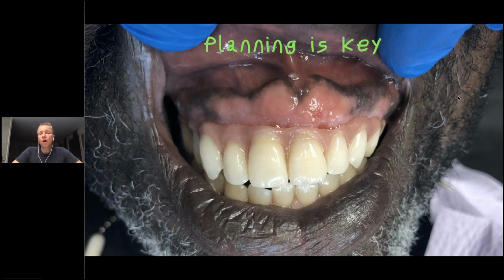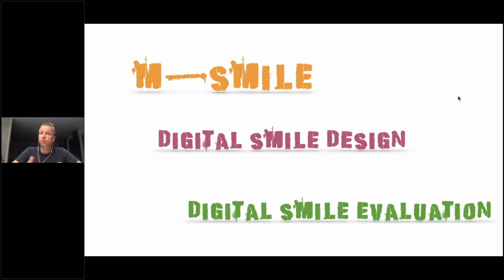So if we talk about smile and treatment planning, as I just mentioned, we have tools available. For example, digital smile design, which is a brand, a name out there, which people just utilize for everything to create a diagnostic or smile or whatsoever. I'm very careful with that word.